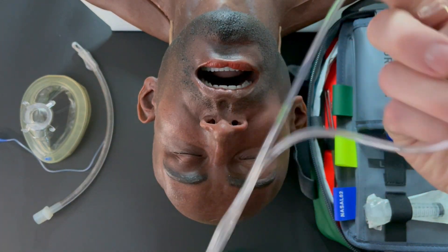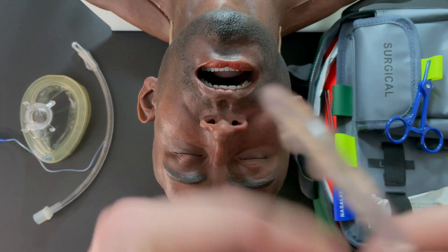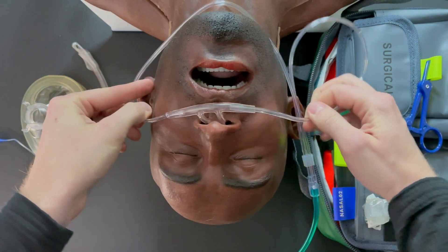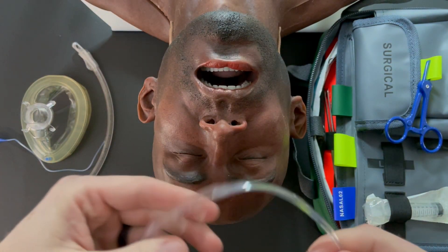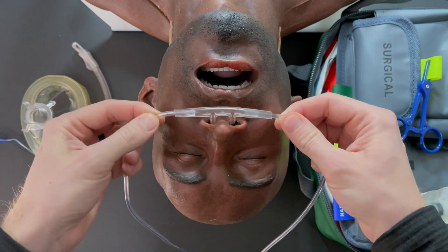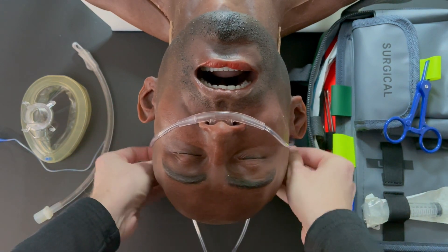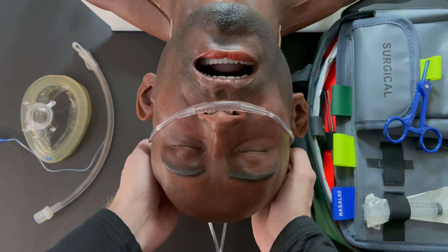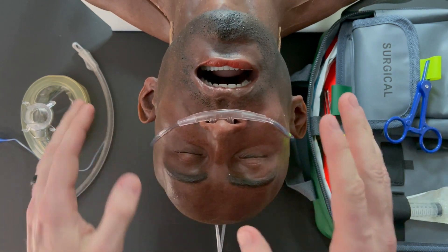I don't recommend putting it on the normal way — taking it and looping it around the ears. Instead, keep the prongs facing the correct way, but come from the top of the head and route it like this, and just don't fasten it. Just tuck it underneath the head as long as that works.